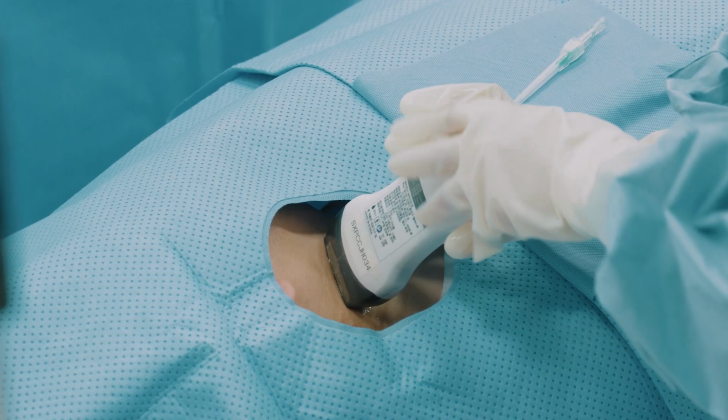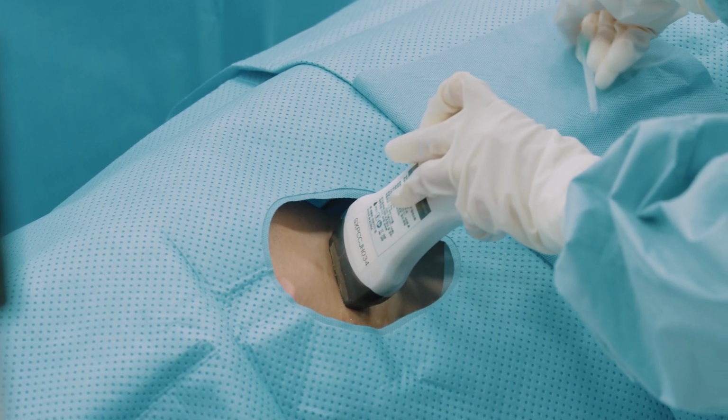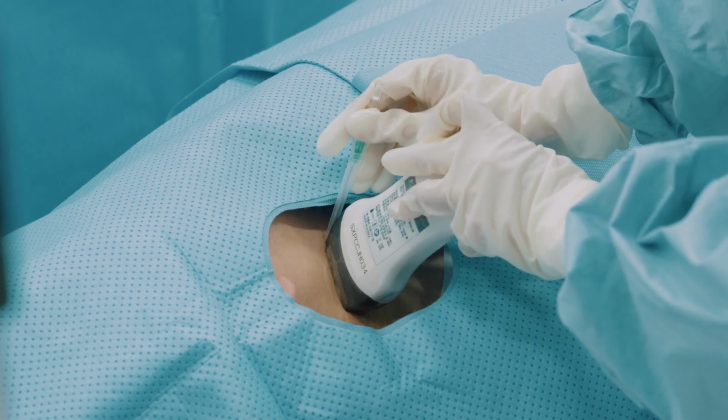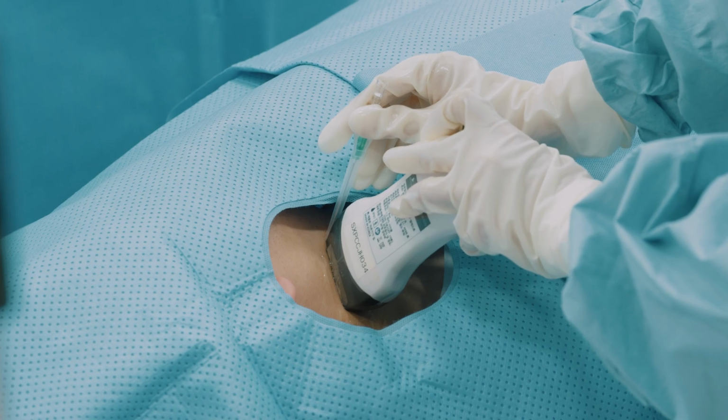The single operator technique optimally aligns the procedure by having the operator hold the ultrasound probe with the non-dominant hand, and advance the needle with the dominant hand.